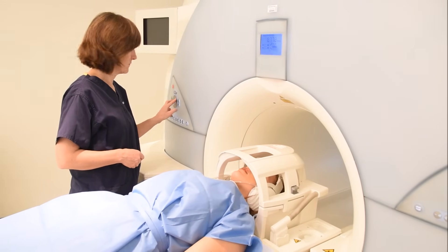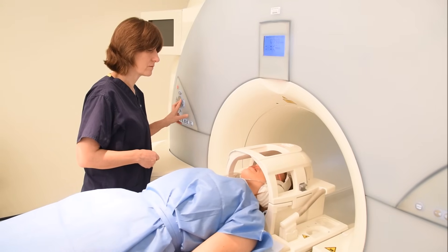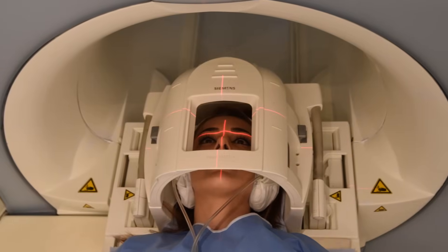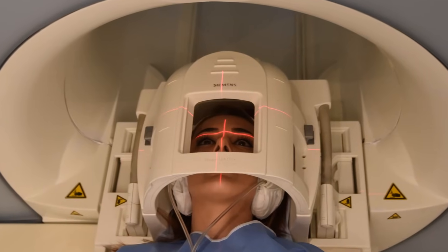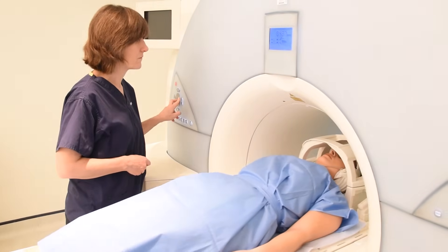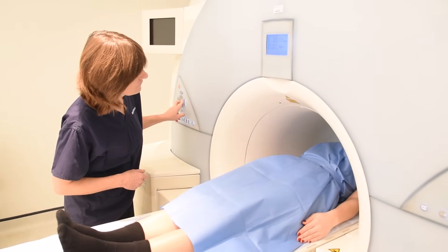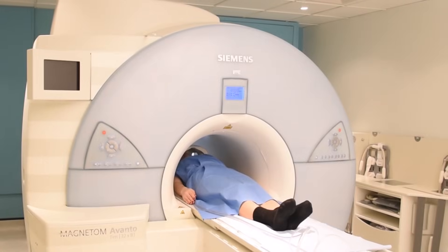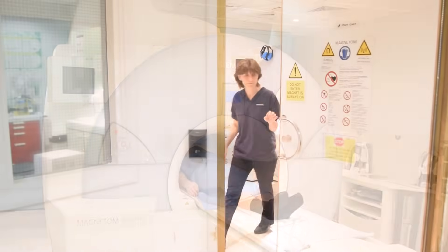Center to the glabella, and move the patient carefully into the scanner. Make sure they're calm and comfortable before you leave the room.